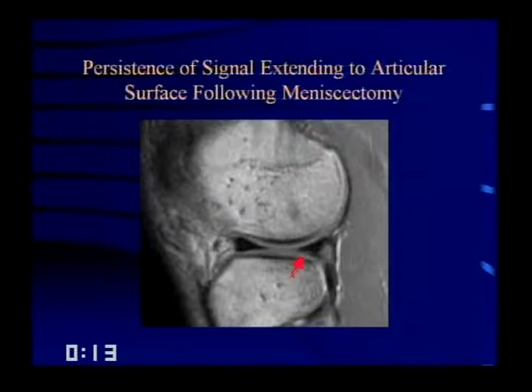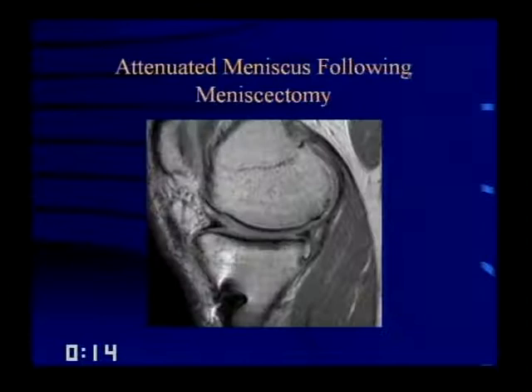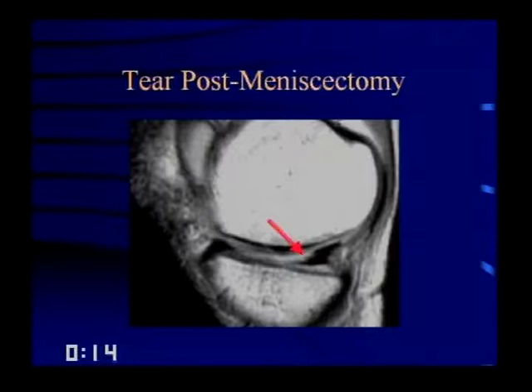If less than 25% of the meniscus has been removed, it often looks normal. Here's a very attenuated post-meniscectomy meniscus that maintains a relative meniscoid shape — that's a normal postoperative appearance. In contrast, another example doesn't maintain a meniscoid shape and has a jagged edge — that was a tear after meniscectomy. Look for those jagged edges.